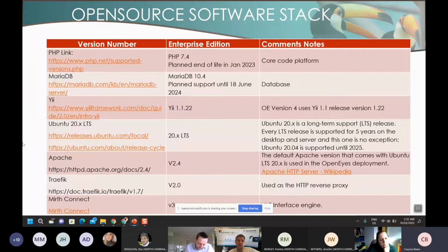The only thing we have officially certified it with at the moment is Chromium and Chrome. However, it's something that can be tested as part of your UAT. We haven't heard of any issues with the other browsers. It's just that, as you can imagine, there are quite a few, with Opera and all the others. Okay, I think I've run out of questions, so somebody else will have to go.